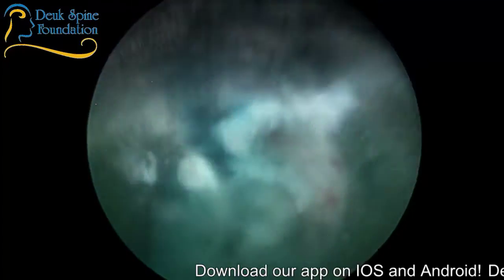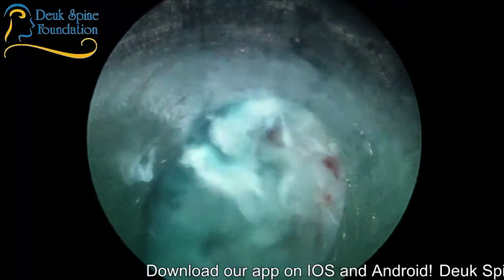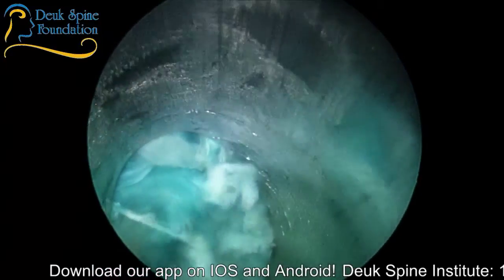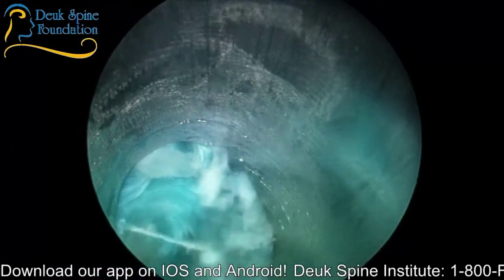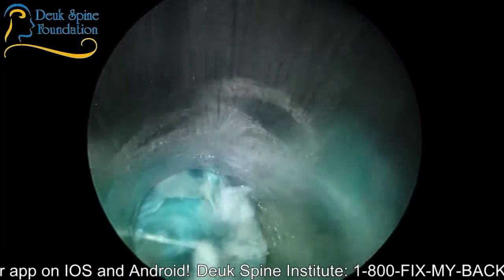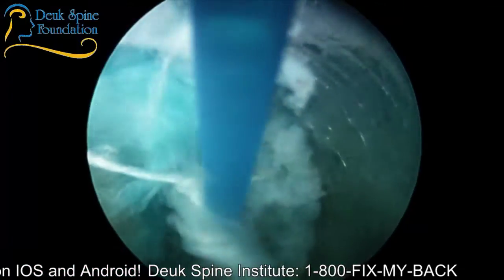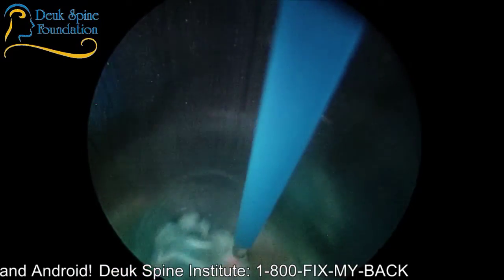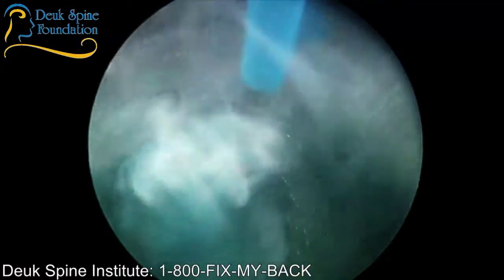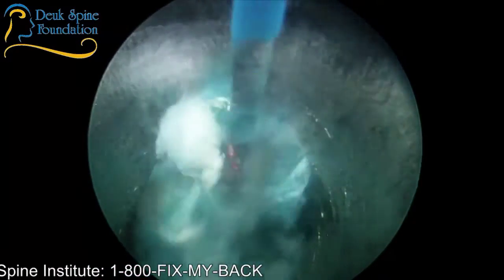All right, so off to the right there at 3 o'clock is the end plate of S1, and the annular tear is just off to the left there. And what happens with an annular tear is you get this inflammation in the annulus. And the inflammation is what causes the back pain or neck pain.